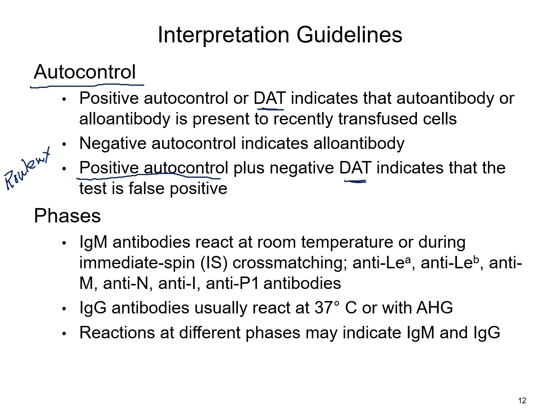They cling and stick there for a little while, and after you've spun your gel well down and most of your cells go to the bottom, when you take it out of that centrifuge and it sits a little bit and that atmospheric static changes, you'll see those cells come down and settle across the very top of that gel matrix, and then you'll have a little layer at the top and a little layer at the bottom. So sometimes you can have some false reactivities that way.